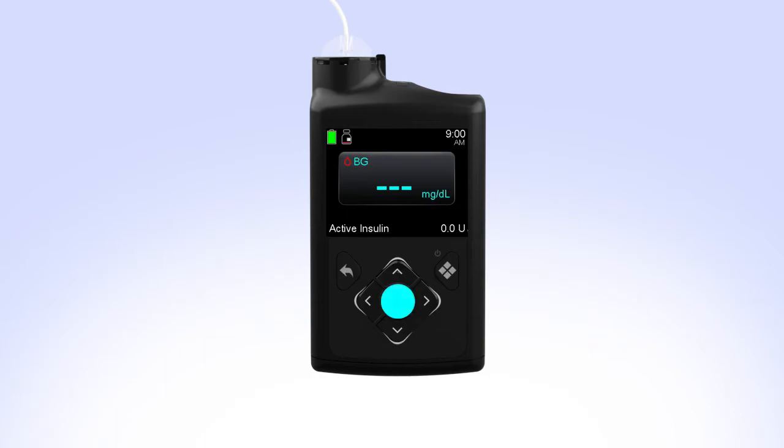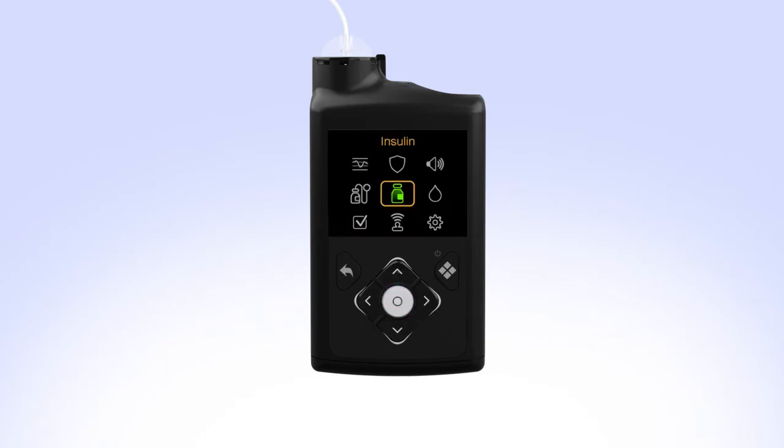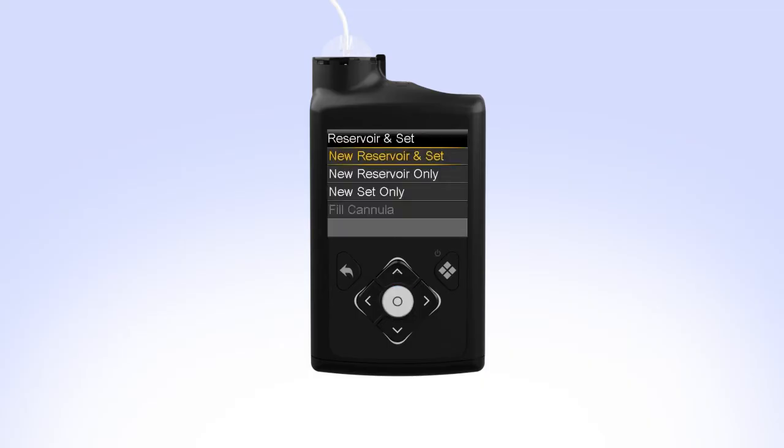To begin, press Select to view the menu screen. Use the left button to highlight the Reservoir and Set icon, then press Select. Select New Reservoir and Set.